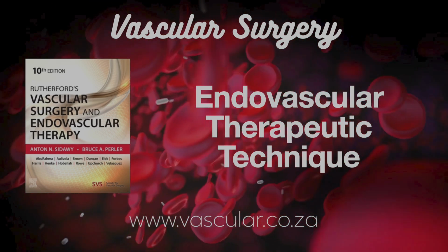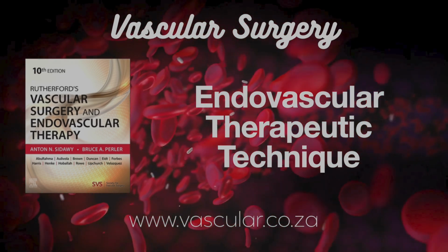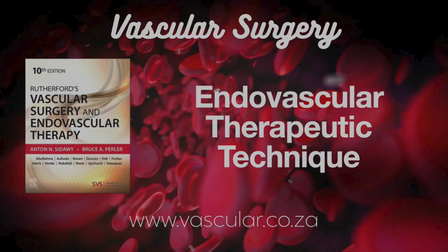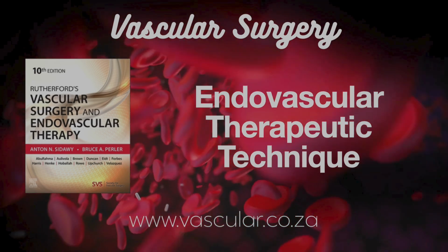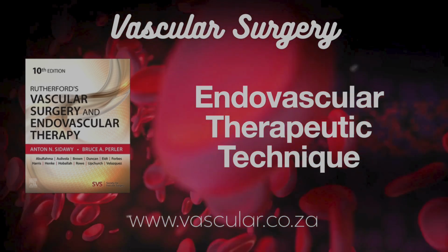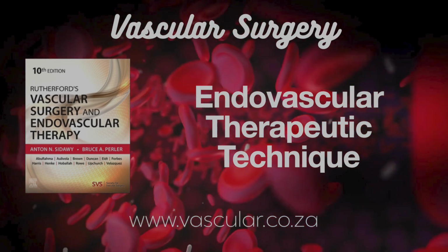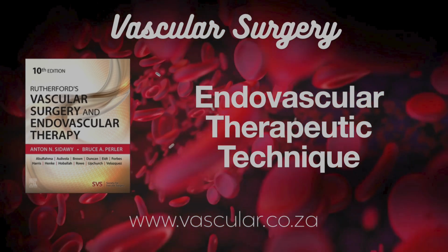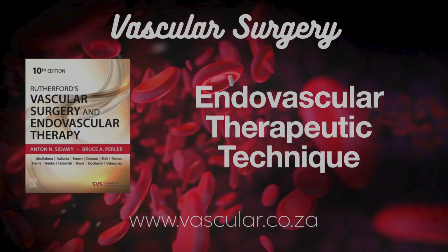It uses polyester sutures deployed by nitinol needles. It also maintains wire access during deployment, used for EVAR. One trial, BRAVO 3 in TAVR, suggested ProGlide might have fewer vascular complications than ProStar XL. So suture devices offer robust closure, especially for big holes. Okay, that covers the closure devices. Now, the final section of the source gets into the how-to of the procedures themselves, starting with PTA technique.